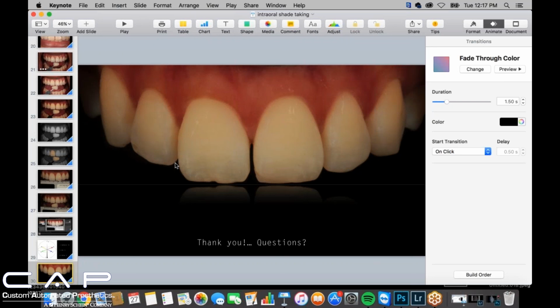And we have a before and after of right after the tooth is prepped, right? So you've got the Novocaine, which is white. It makes the tissue look white, it chases the blood away. And then the patient's mouth has been open for an hour, 2 hours, or however long it's been, breathing through his mouth, and you've got the air and all this stuff.